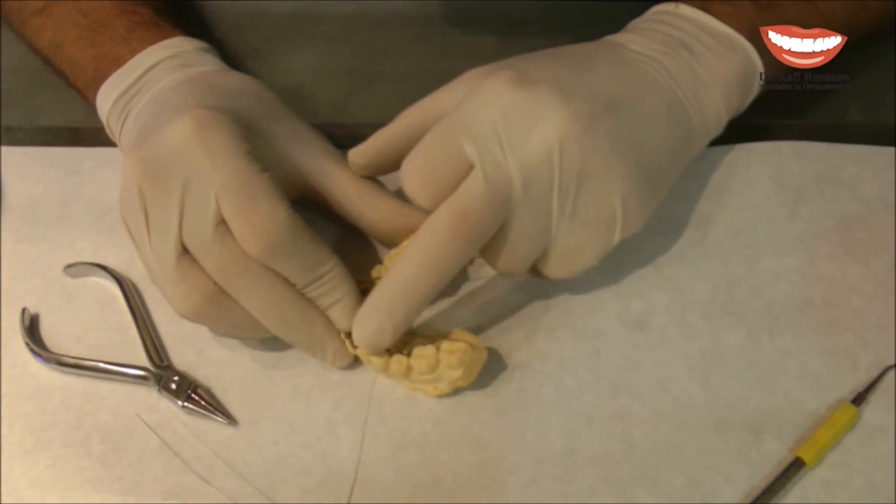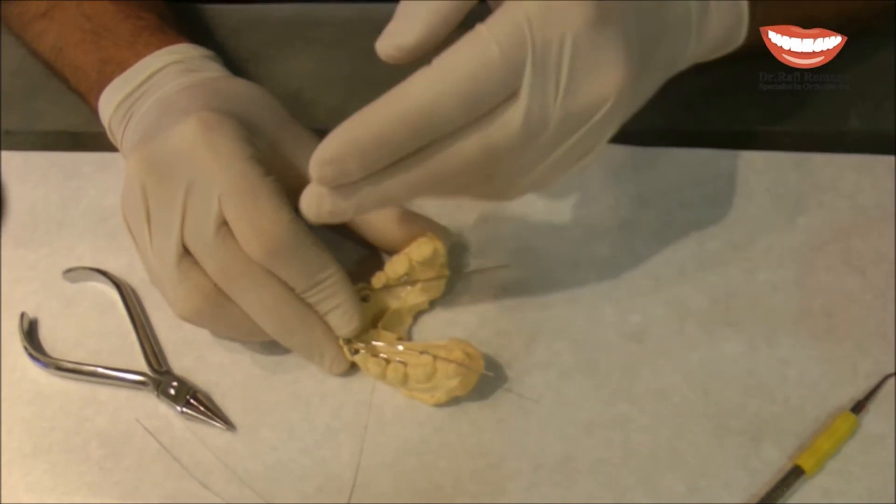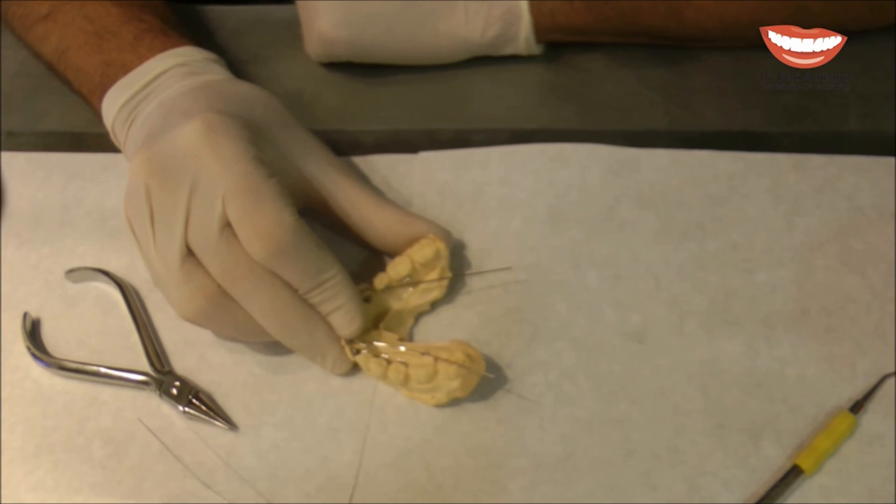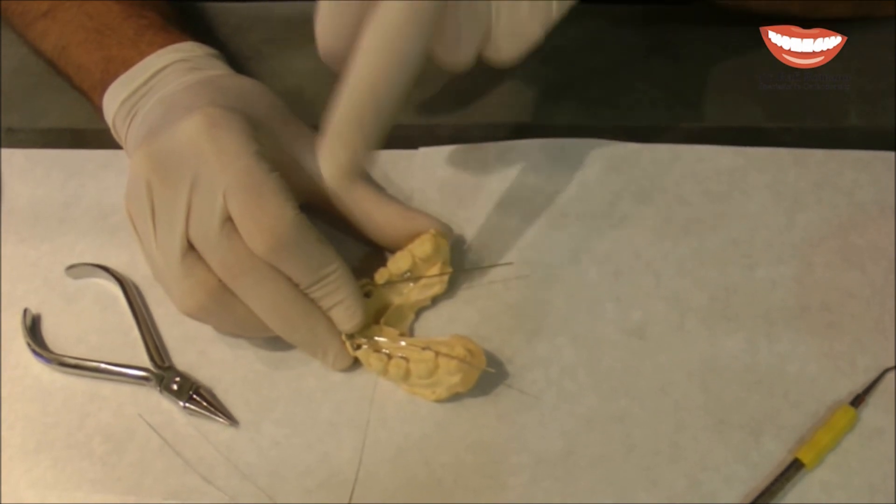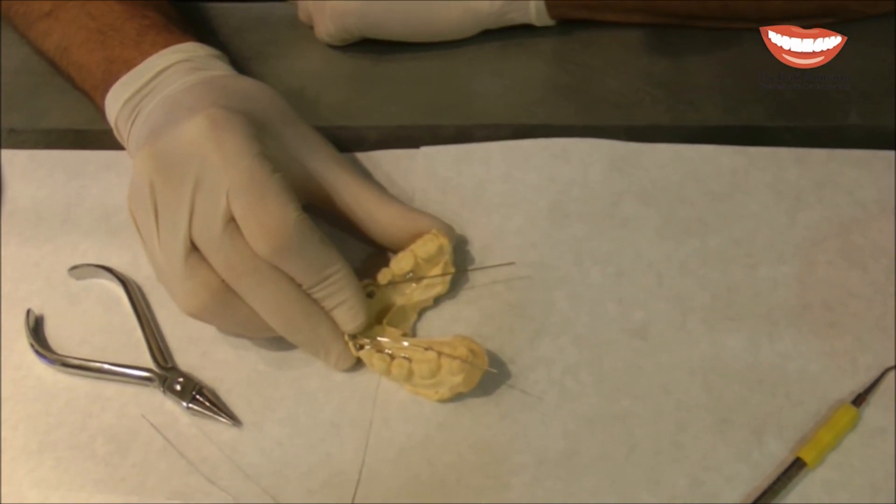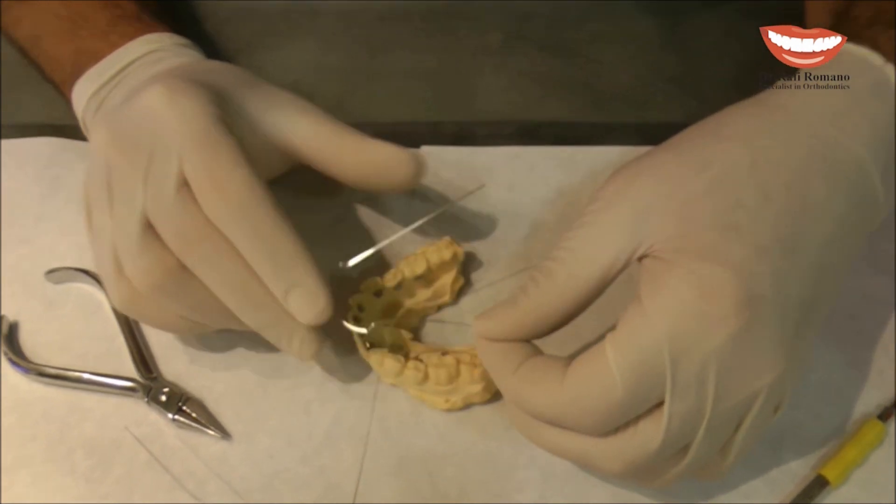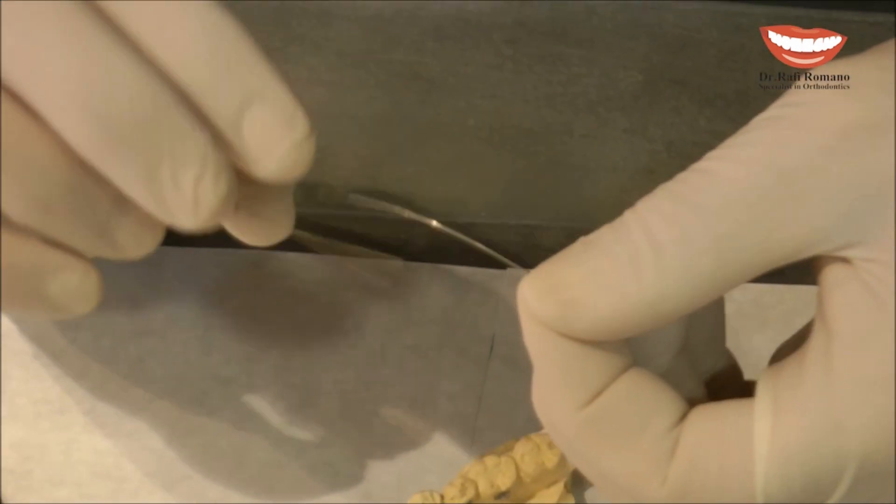The premolar will have a tendency to move inside which is very good in this case. And we will level the curve of spee.